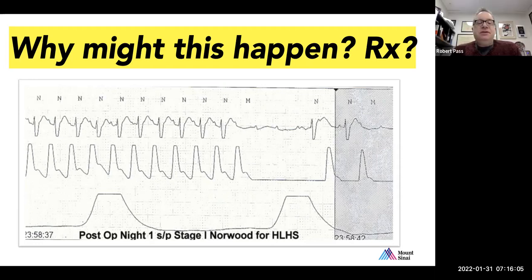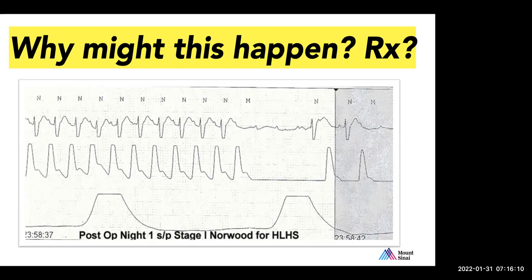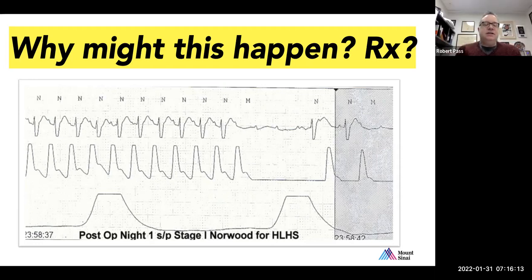Yes, well, the answer is that's correct. It's about 2/3 of the time conduction will recover. And the earlier you see it, the more likely it is that it will recover. If this were occurring on post-op night 8, we would be a little less confident, or a lot less confident. And the data suggests that if by post-operative day 8 or 9 you see something like this, only about 1 or 2% of the time will there be recovery of conduction. So this would be a very worrisome finding late after surgery, not as worrisome early after surgery, but definitely we would pace this patient and hope.